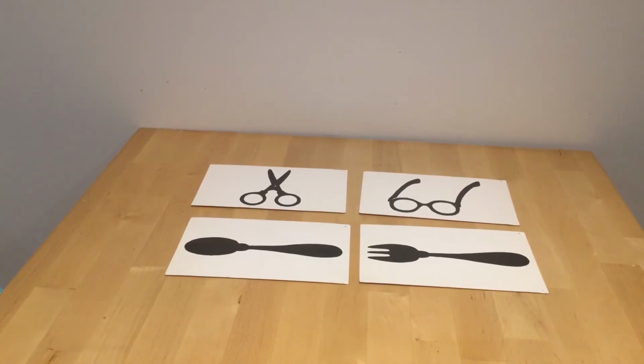The third assessment that I'm going to look at may be familiar to you. This is the bust distance test. On the table I have the first set of cards, and this test can be carried out at a variety of distances: 3 meters, 2 meters, or 1 meter. You can use the real objects that we had for the near assessment, or the child can name or match the pictures.